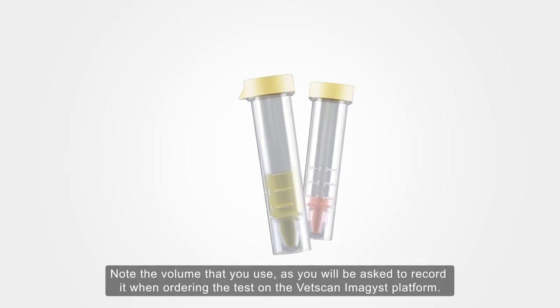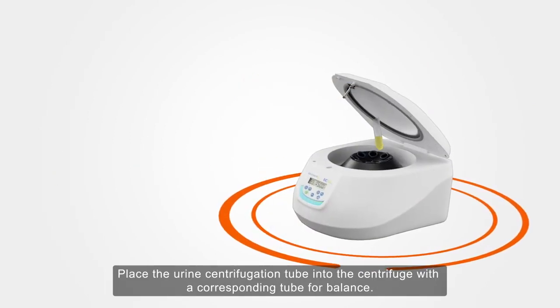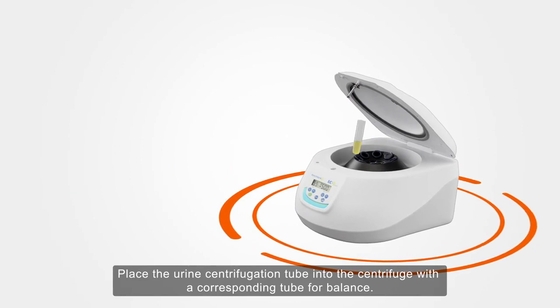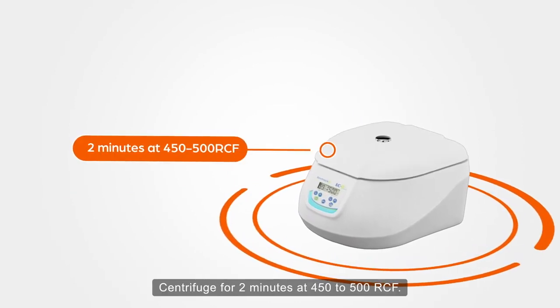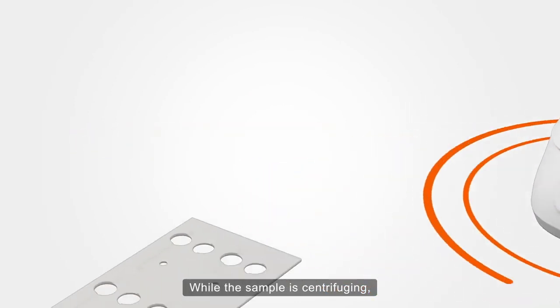as you will be asked to record it when ordering the test on the VetScan Imagist platform. Place the urine centrifugation tube into the centrifuge with a corresponding tube for balance. Centrifuge for two minutes at 450 to 500 RCF.